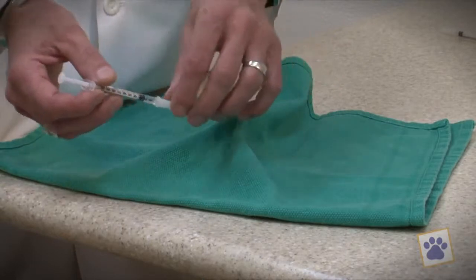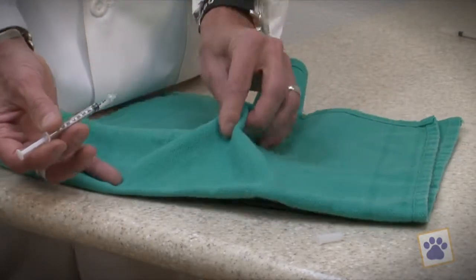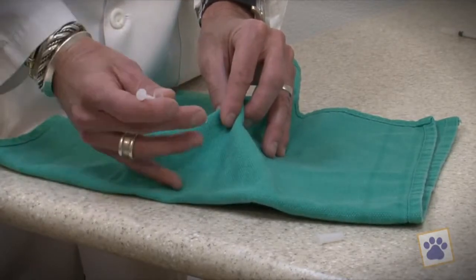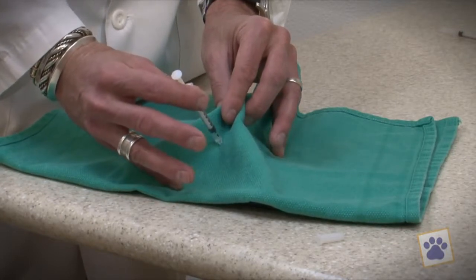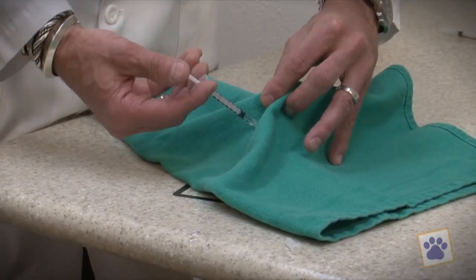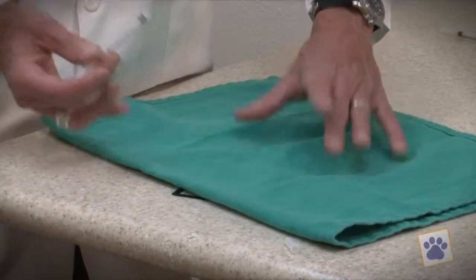Normally I would take the scabbard off the needle, then form the skin tent. Right beneath your index finger, between these two folds, plunge the needle through the skin, perfectly perpendicular to the skin, and then inject. Pull the needle out and you're finished.